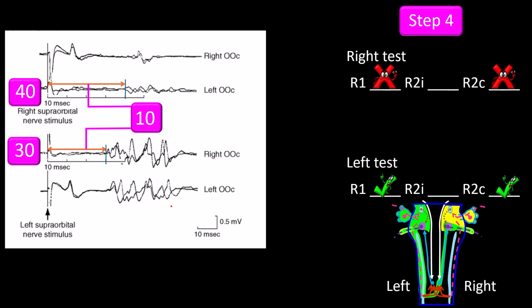Most revealing is that the facial motor nucleus and the facial nerve motor fibers going to the orbicularis oculi are normal, and in yellow those tentatively considered abnormal based on the abnormal right R2 contralateral response, which are the right spinal tract, the caudal region of the right spinal nucleus of the trigeminal nerve, and the fibers that from there ascend to the contralateral facial motor nucleus.